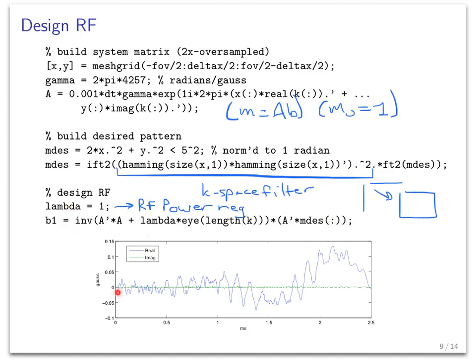And so if I do that, I get this pulse. It's mostly real. It has a small imaginary component. It's really just due to numerical amplification of some numerical noise here, right? So you could pretty much just set that to 0, and you get the same pulse. Okay, so it's mostly real here.